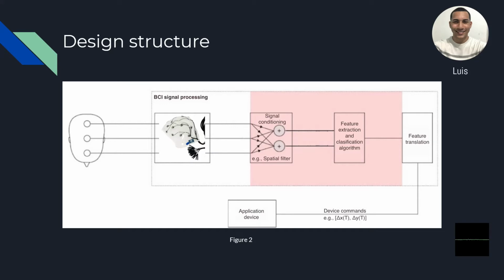This consists of taking the processed data and, based on previous training, an algorithm determines the type of movement that the patient signal shows. The result of classification must be translated into the format that the equipment used as prosthesis can understand.